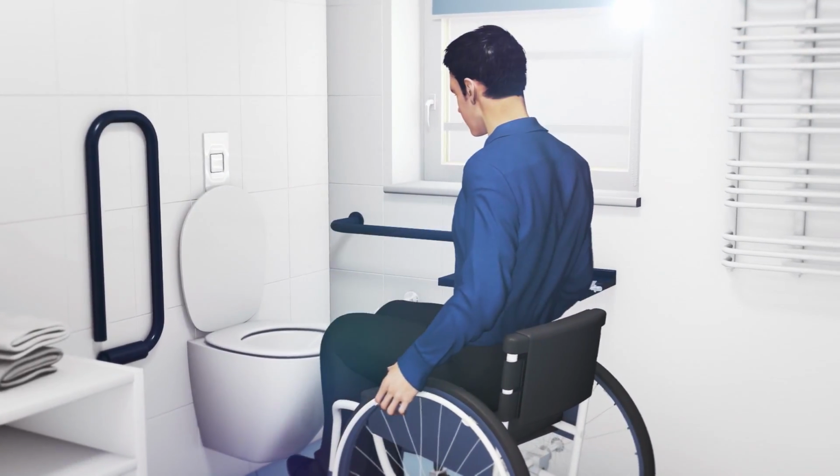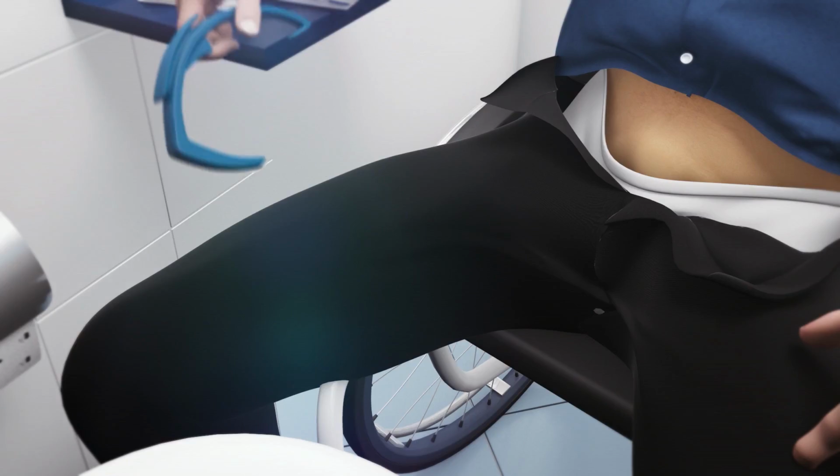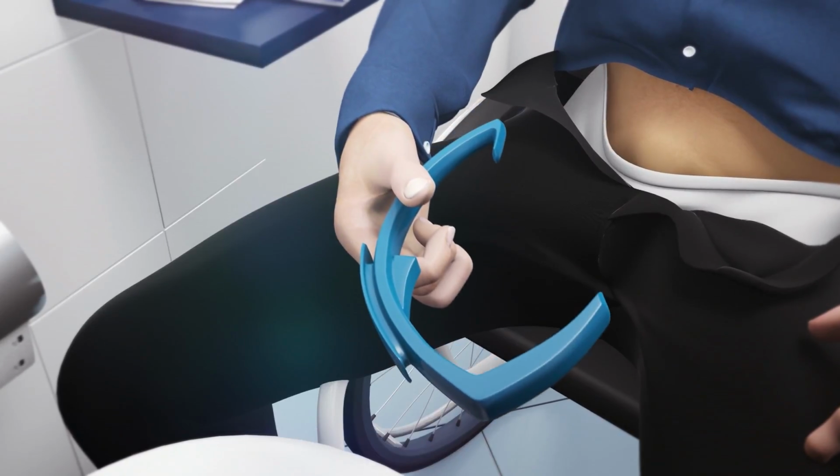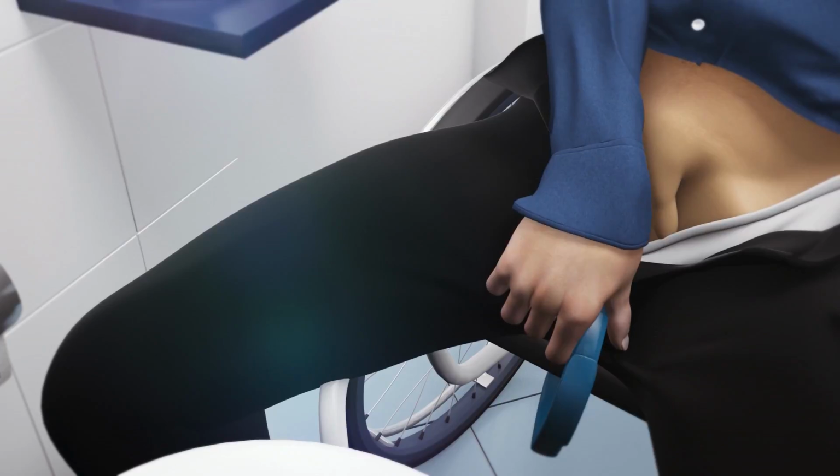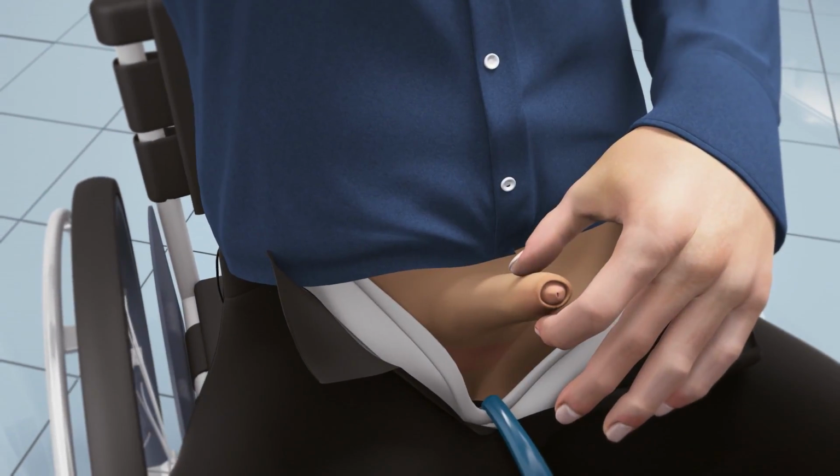Position yourself for catheterization. Using the freehand catheter, hook the top of your pants, pulling them down and then securing the other end of the device under your chair. Use an antiseptic to cleanse the urethra opening or meatus.